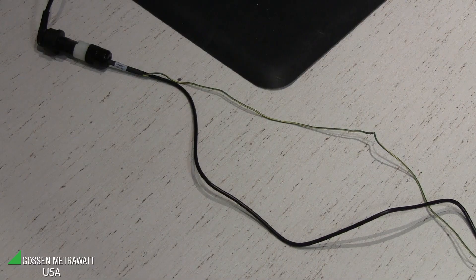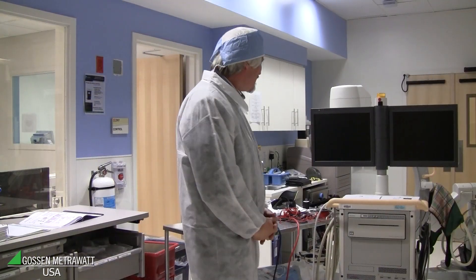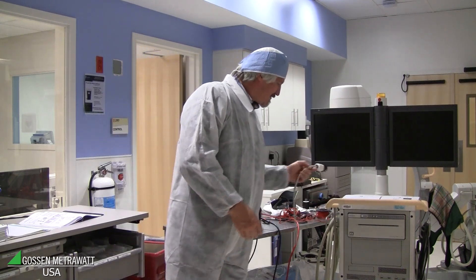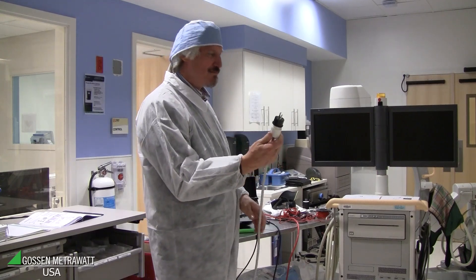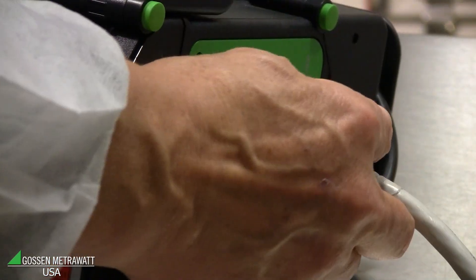For dissipation leakage and touch current leakage measurement, we would like to use a very special cable to get very accurate measurement. This cable has a black cable and a green and yellow one, so the protective earth connector is separate to connect on the reference point of the system. We are doing touch current measurement on the mobile X-ray equipment. This mobile X-ray equipment has a normal plug, which is connected to the tester and the test socket of the tester.